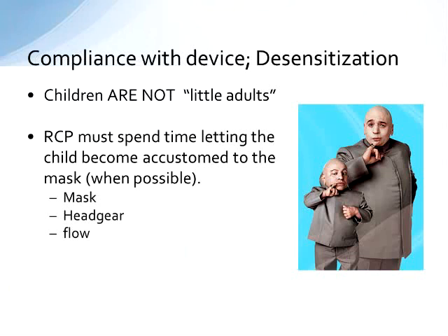So compliance is absolutely probably the number one reason patients fail non-invasive ventilation. So desensitization is a big subject here. It's important to remember that children are not just teeny tiny adults. You have to spend time with these kids to get them accustomed to the mask whenever possible. If they're in impending respiratory failure, you don't always have that luxury. Sometimes it's a quick conversation with the child and the parent as you're quickly applying that mask, and that education might come later. But if you're given the luxury of doing it beforehand, that always works so much better, to allow them to see the mask, to see the headgear, to feel the flow coming out of the machine.